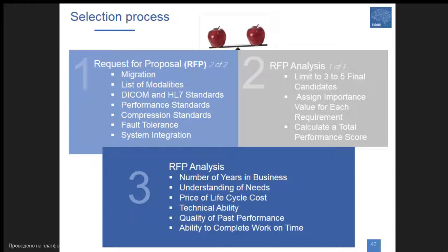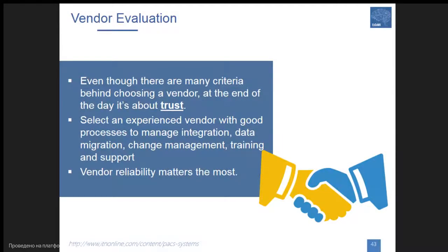Of course, you need also to analyze the number of years in business, the technical ability of the vendor, ability to complete work on time, which are difficult to understand or evaluate. And in vendor evaluation, at the end of the day, it's all about trust. You need to select an experienced vendor with good processes to manage integration, migration, change management, training and support, and finally the vendor reliability matters the most.